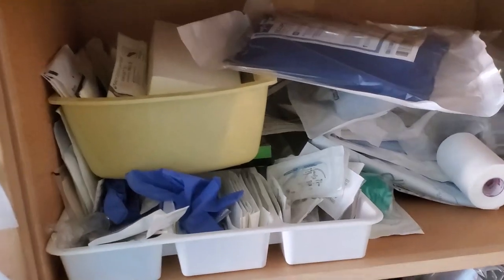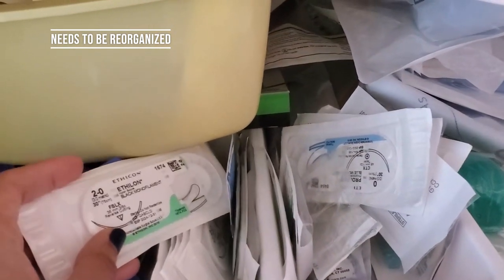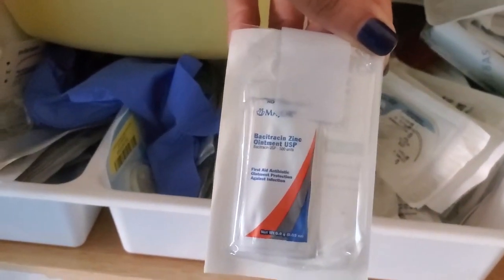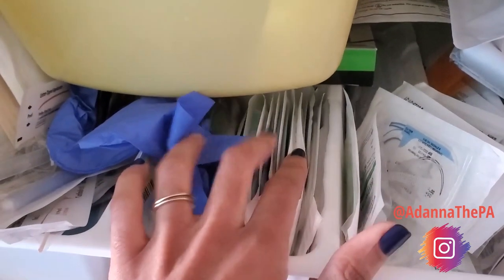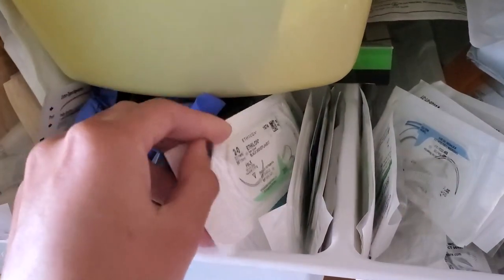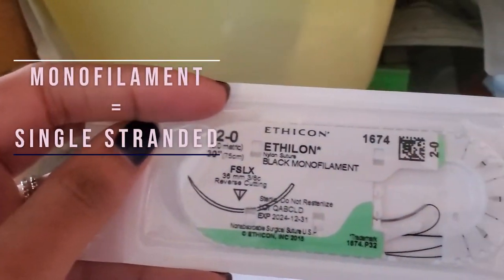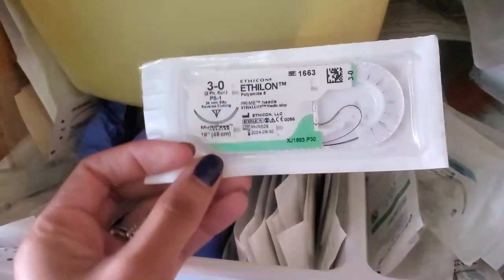So this is our closet and it has all of our various items. We do have a bunch of sutures here, for if we have to put a line in, and some other various things as well. This is just bacitracin, so you'll put that on any wounds, like maybe road rash, that may need a little bit of that ointment. We have all of these sutures here. If we ever need to suture anything, this is 2-0 Ethilon monofilament. You can see that there. We use Ethilon 2-0 or 3-0, which I have here.